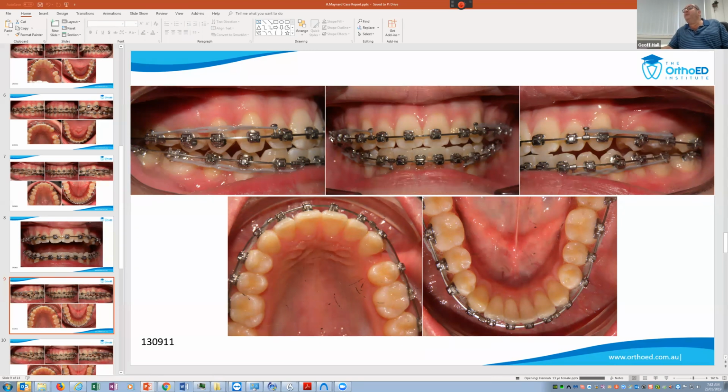So at this particular point, before you have a cardiac arrest, I've still got space distal to that upper left canine that I'm going to close up. So what am I going to do now? Because this comes back to always, what's our critical path to success? The class 1 canines. Exactly. So that's what I'm looking at. How do I get that now? What are the things that I'm going to need to do? Is much of that class 3 elastic? Yeah. What else?